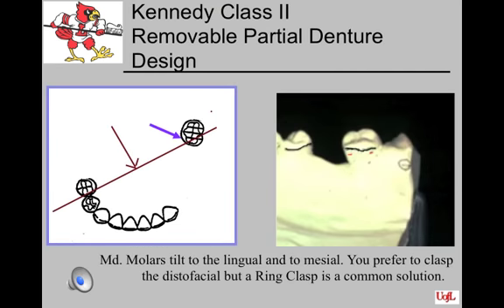The molar abutment on the mandibular is often tilted to the mesial and to the lingual, and we happen to find that the retentive position on the mesial lingual is the best position for our direct retainer. You look at it this way. If I put my direct retainer tip on the distal lingual, I have to have the first 2/3 of the direct retainer above the survey line.